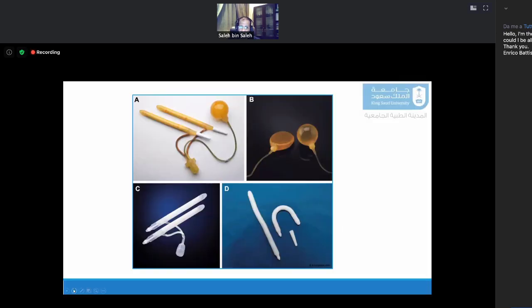Also, I have to mention the three pieces penile prosthesis from Boston Scientific come with two types of reservoir. We have the spherical reservoir and we have the flat reservoir, which is a good one to implant if you are considering ectopic reservoir placement. Next slide, please.